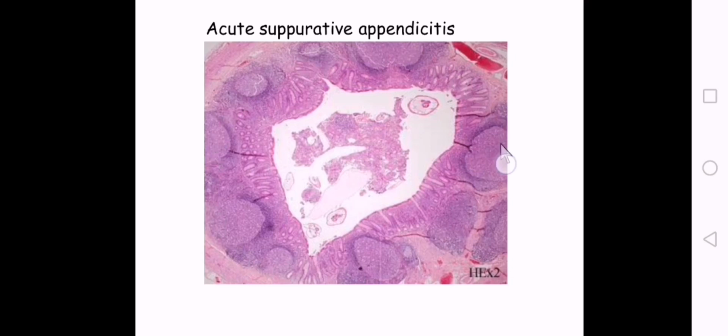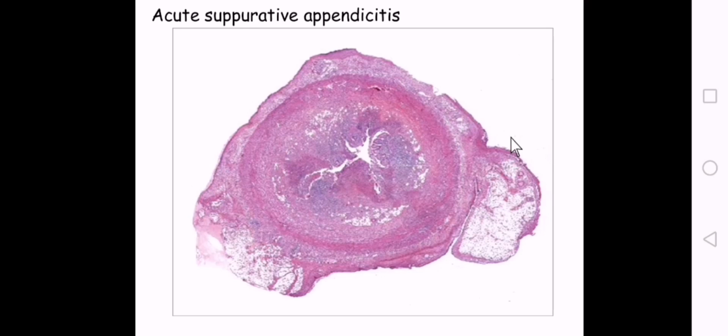submucosa also shows يعني inflammatory process، اللي هي الانفلاماتوري process اللي هي الإديمة والinfiltration by polymorphonuclear leukocytes، plus أكو hyperplastic lymphoid follicles. يعني شنو hyperplastic؟ يعني كبر حجمها، hyperplastic lymphoid follicles. هاي الصورة هي نفس الشي، هماتين اللومن بيها necrotic debris وهم اكو ulceration and inflammation بالميوكوزا. السبميوكوزا also shows edematous changes with infiltration of polymorphonuclear leukocytes.